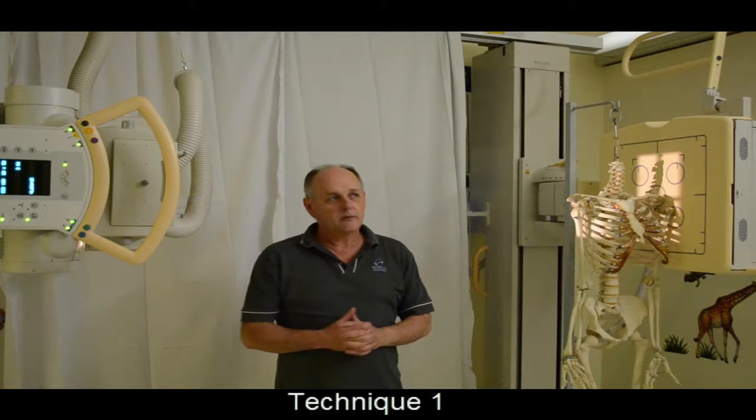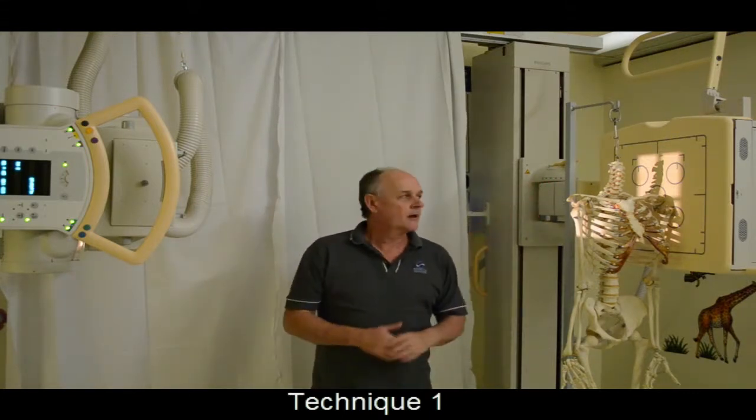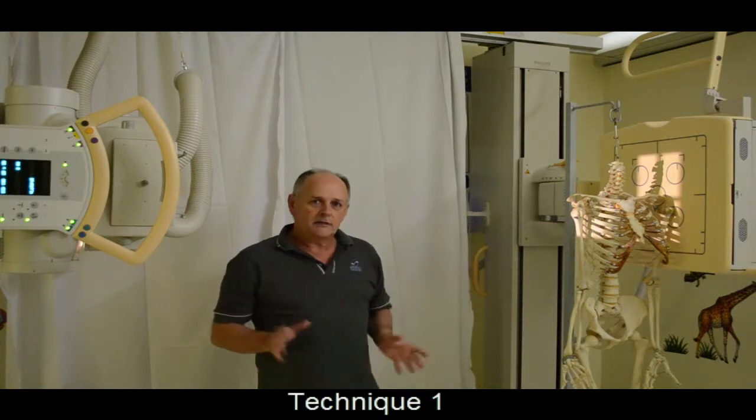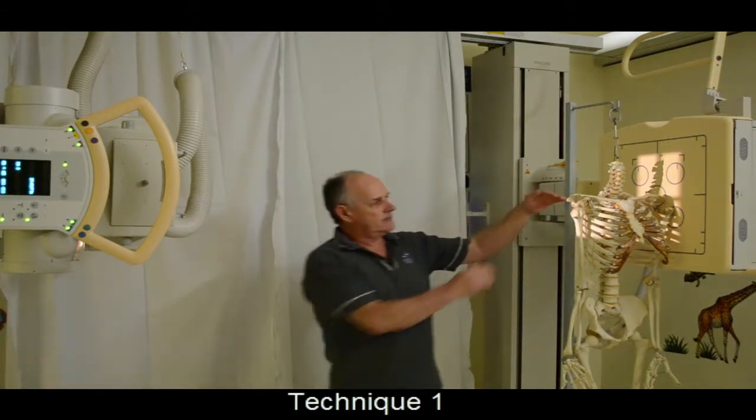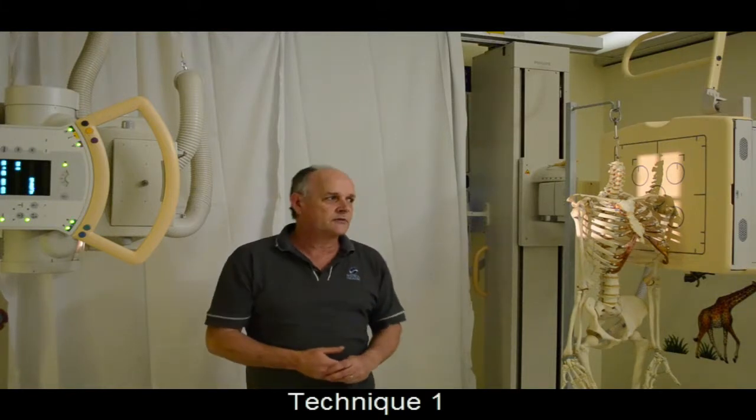This has advantages in terms of clearing C7 from the humeral heads. The disadvantage of this technique is that there is radiation of the thorax which is not necessary for demonstration of C7.